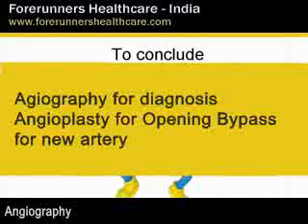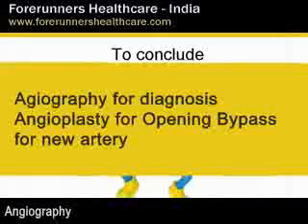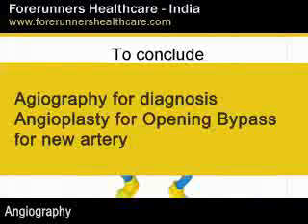So to conclude this session, we have seen that angiography is meant for diagnosis of the blockage, whereas angioplasty and bypass operations are meant to provide blood to those areas which were not receiving blood. Angioplasty is only the opening up of the blockage, while bypass is bypassing the particular blockage. We do not touch the blockage but provide a new pathway for the blood to reach those areas which were not receiving.